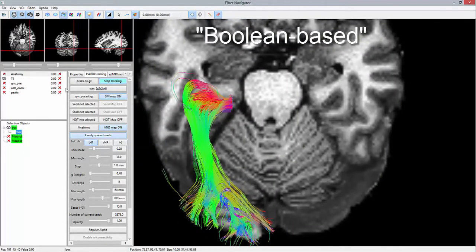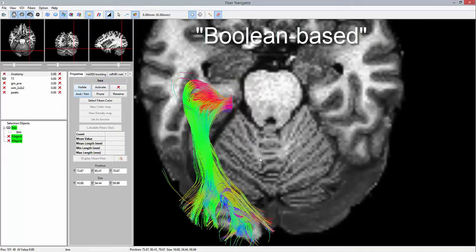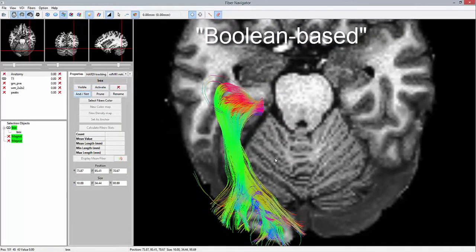For filtering purposes, a NOT region excludes any streamline propagating in the right hemisphere.